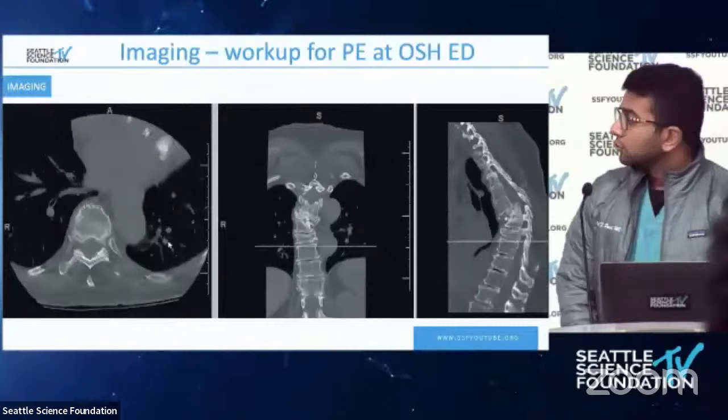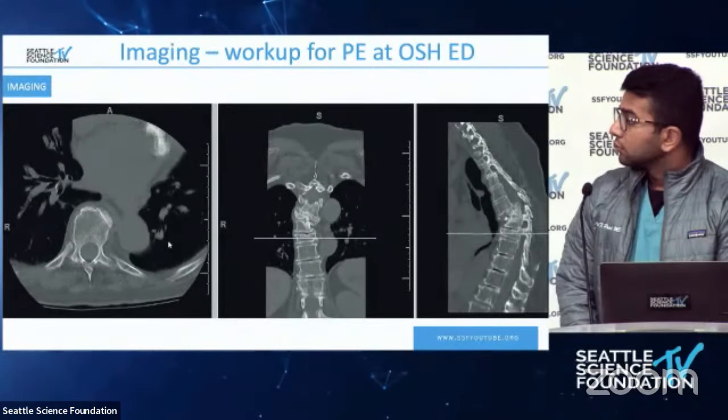Yeah, could you go back to the CT there real quick? What are you looking for there? Well, when you look at it, it almost looks like a hemivertebra, just the morphology there. I haven't seen a ton of those, but when you do see them, it's something you kind of wonder about. It doesn't seem like it has that morphology.